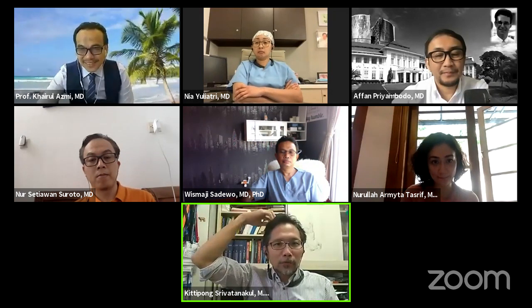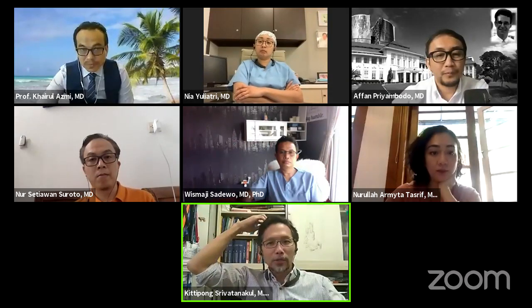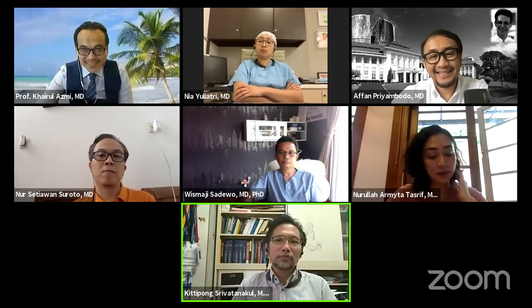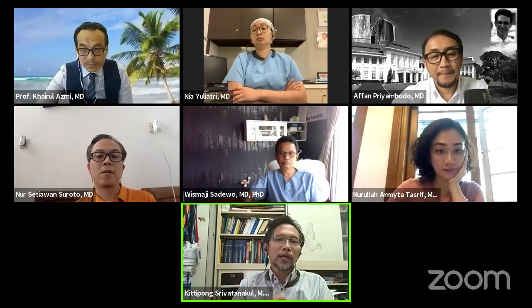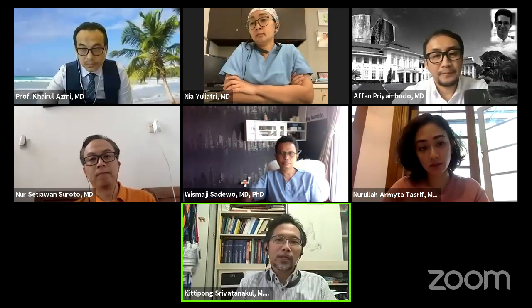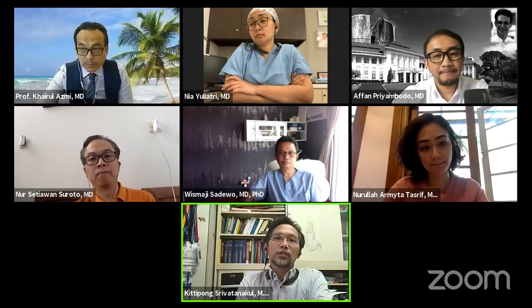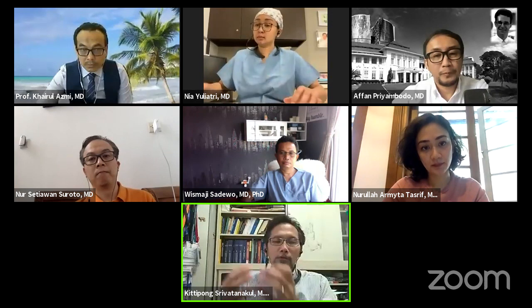So it's a high risk skull base. Parasagittal meningioma, I don't think we need to embolize everything. Just between you and me, but this is online on YouTube. It's for training also, okay? For skull base, these are serious things. We have all the connections from the ICA, from the vertebral arteries, all those cranial nerves. Anything wrong can happen very easily at the skull base. But for hypervascular skull base lesions, the surgeons will need the embolization more than they need for the parasagittal ones. And we have more risk as interventionists too. So it's a balance between whether we are going to take the risk or the surgeons will take the risk for us.